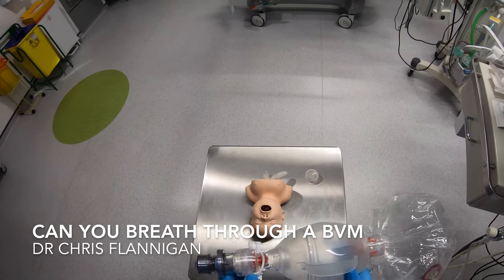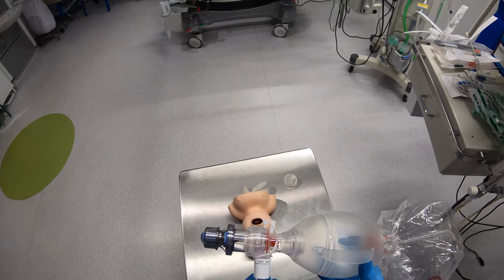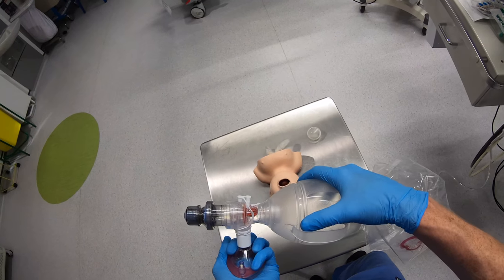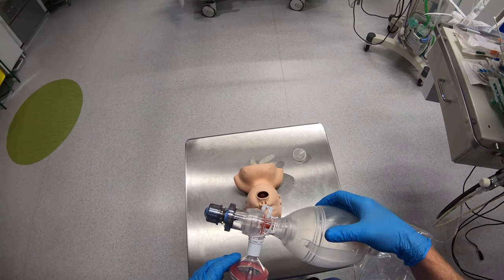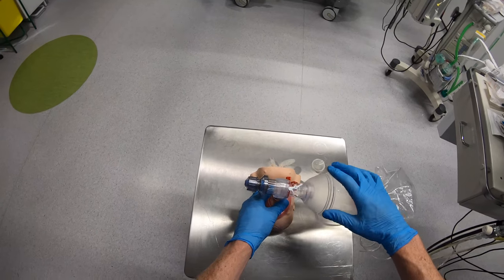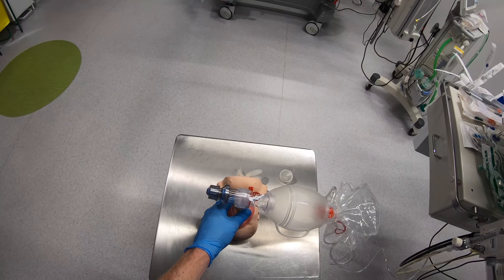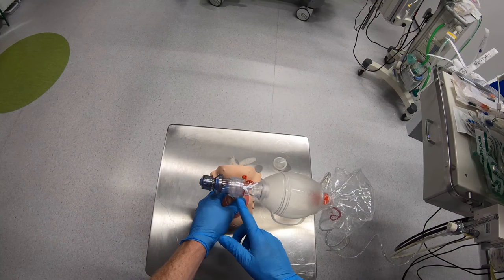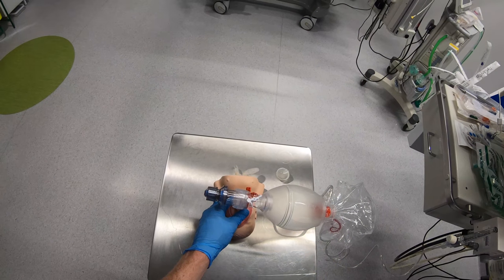One of the key things I want to look at, in particular with a bag valve mask, is this little valve here. This is absolutely fine if you're providing positive pressure ventilation to your patient using this, because I'm opening the valve and delivering gas to the patient. What you will occasionally see people doing is just using this to deliver oxygen, with a PEEP valve on, potentially PEEP to your patient, and not squeezing the bag. The problem with this is it requires the patient to exert negative pressure to open this valve before they will get gas and be able to breathe in gas from the self-inflating bag.